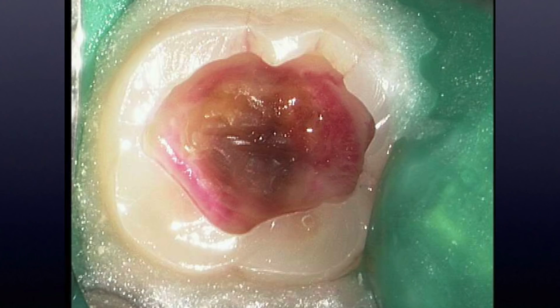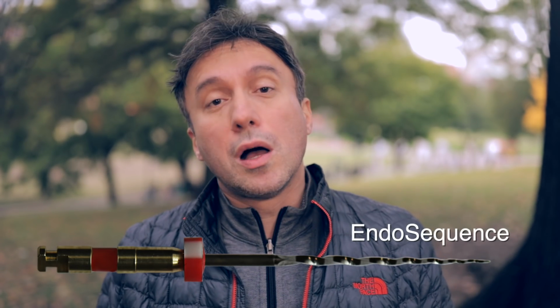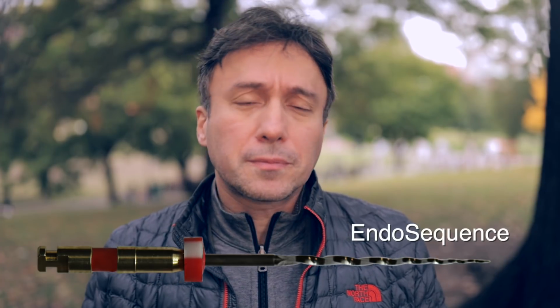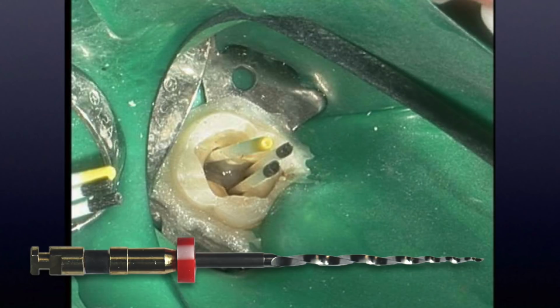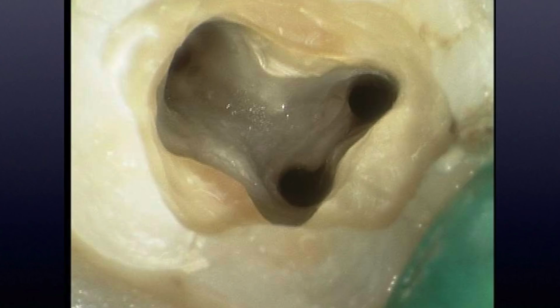Now, after using the caries indicating solution to remove all the decay, access was then made into the pulp chamber. Two mesial canals and a wide oval distal canal were isolated and instrumented using the conventional EndoSequence technique, which was available at that time. These canals were fairly large and were instrumented to a size 40-04 and 50-04 and then dried using paper points. Looking at the high magnification showed clean canals ready for obturation.